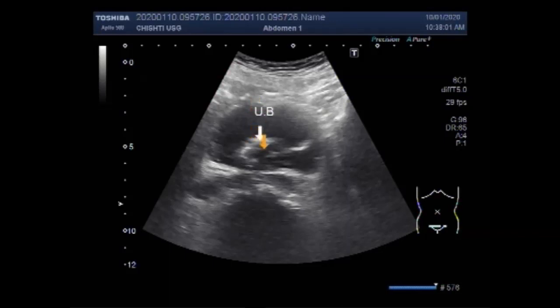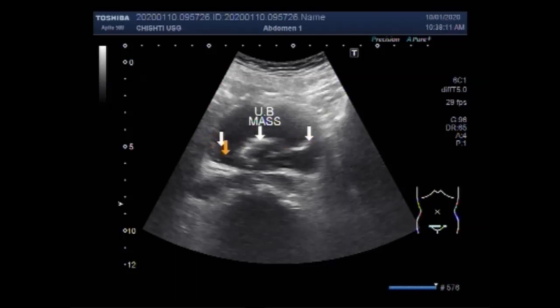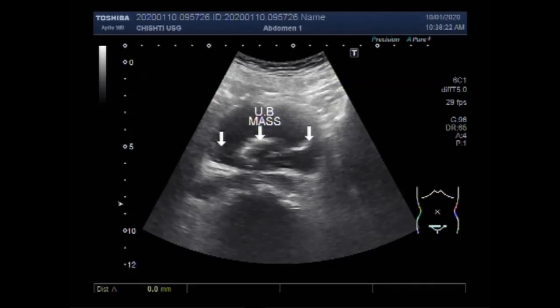This is the mass — the vesicle growth. You can see this mass measures about 59.7 millimeters by 20.2 millimeters.